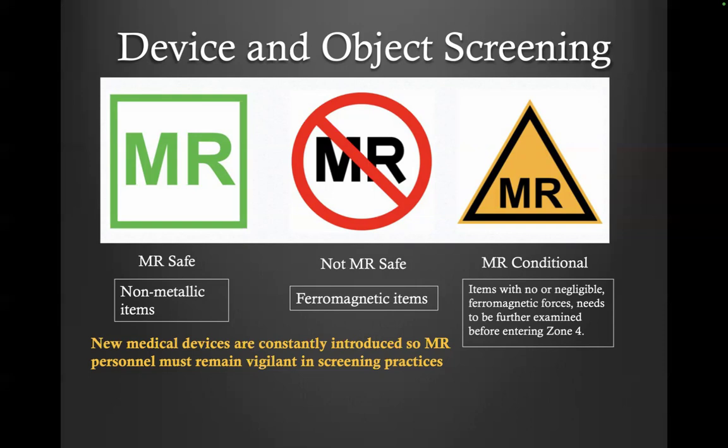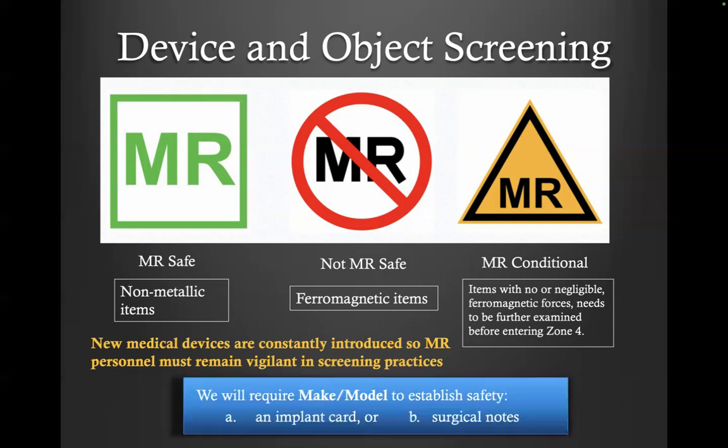And as new medical devices are constantly being introduced, MRI personnel must remain very vigilant in their screening practices. And again, I want to emphasize, if any person has any implant, we will require a make and a model to establish safety. We need an implant card or a surgical note so that we can ensure safety.